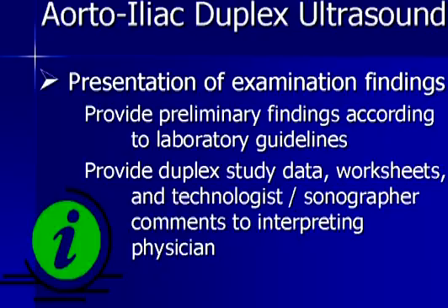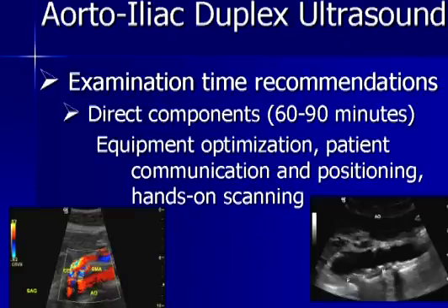You want to present them following your laboratory guidelines and provide all of the data from the duplex examination, the worksheets, and any technologist or sonographer comments that are appropriate to the examination, so that the interpreting physician has all of the data necessary at their disposal.